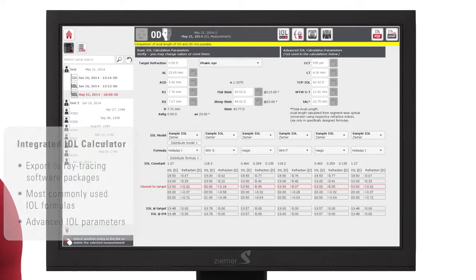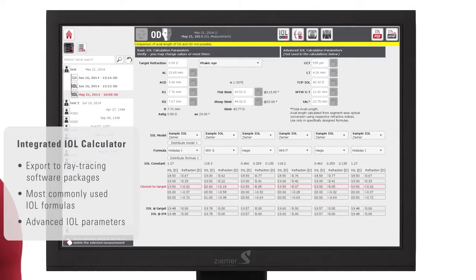An integrated IOL calculator offers the most commonly used IOL formulas, as well as some advanced parameters for future IOL calculation methods. An export function to ray tracing software packages makes it possible to calculate premium IOLs and post-LASIK cases.